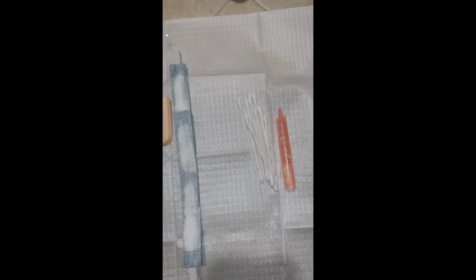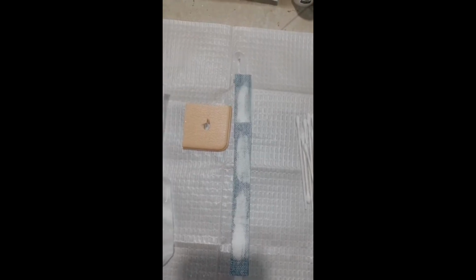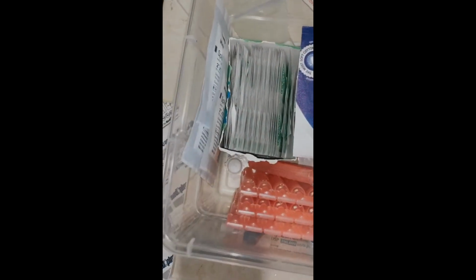Alright, this is what Xander's nightly or daily trach care looks like. A new change of ties, a new foam, and then cleaning around his neck, and then his stoma site. All these, well, the majority of it, comes in the care tray. Other than that, we have stuff set up in his little bin with extra things, so we don't have to go to the cubbies to grab stuff.